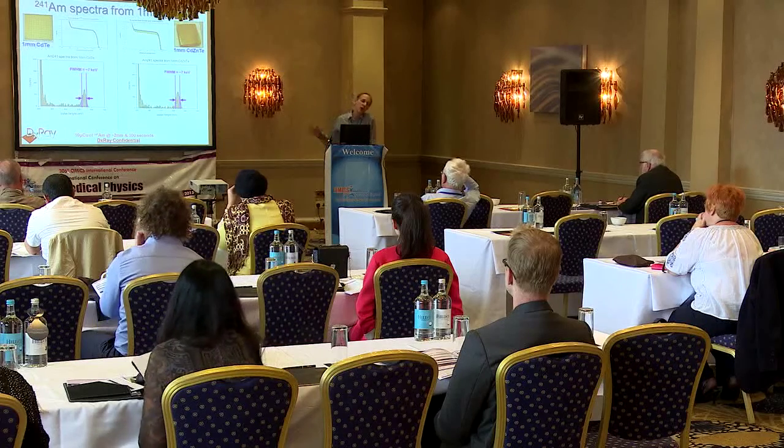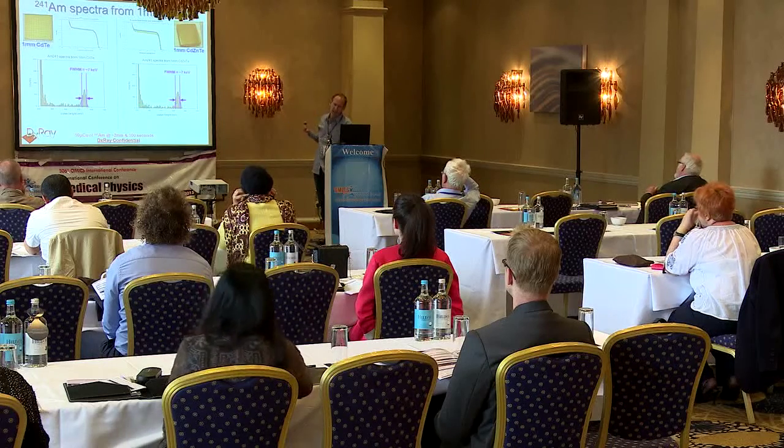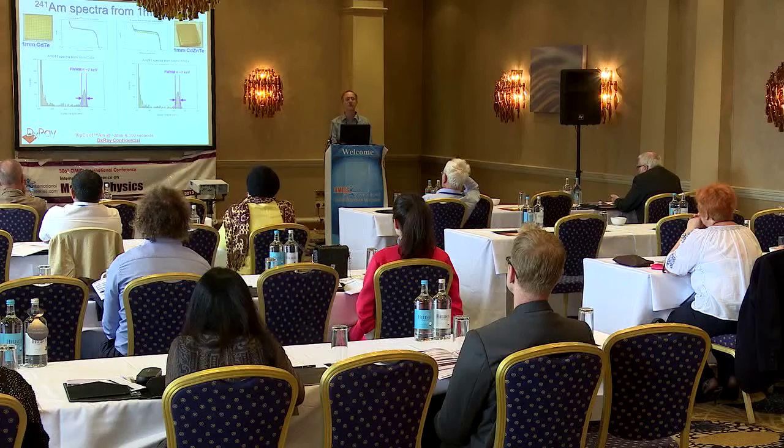Here also I show that you can obtain the same energy resolution from both materials, in this case about 7 keV full width half maximum at 60 keV for americium sources.